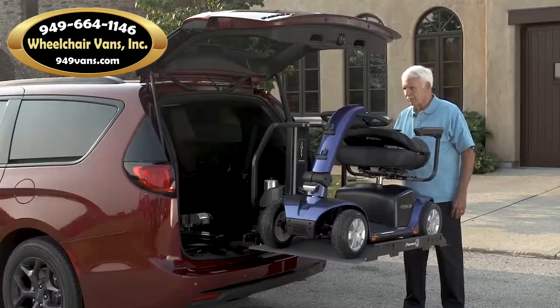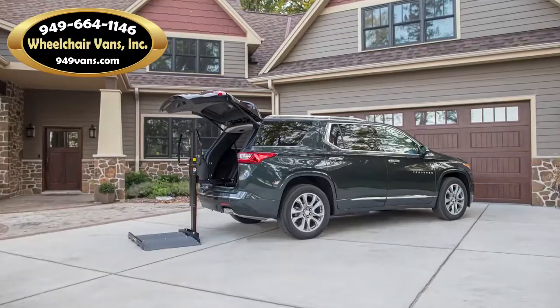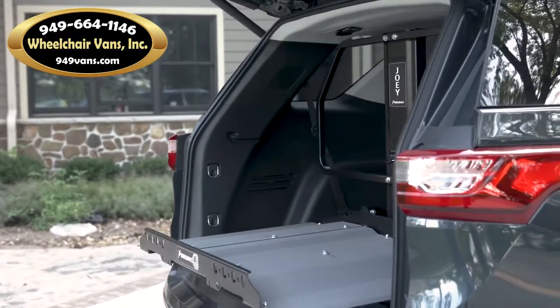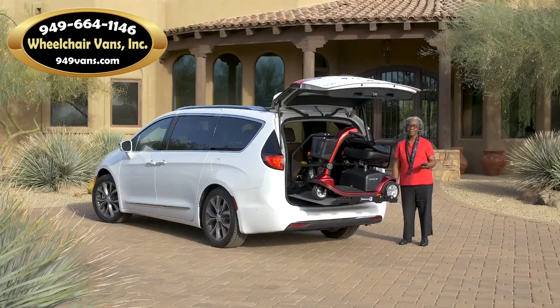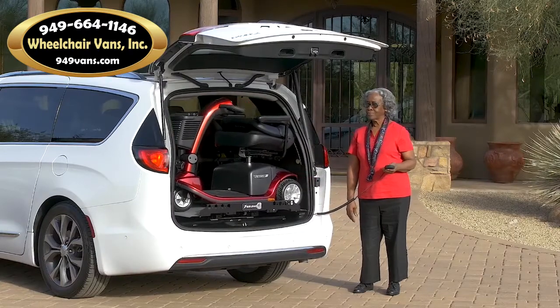Transporting a scooter or power chair doesn't get any easier than with Bruno's Joey. Designed for select SUVs, crossovers, minivans and full-size vans, the Joey offers a drive-on, drive-off platform and easy operation to load mobility devices weighing up to 350 pounds or 159 kilograms.